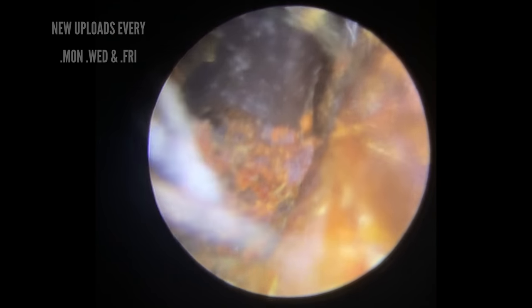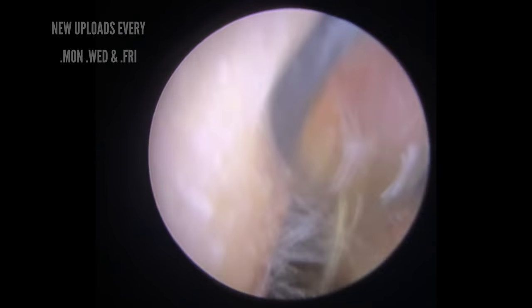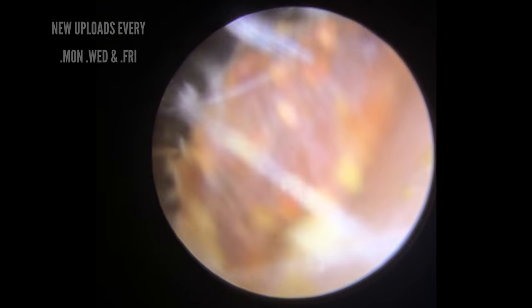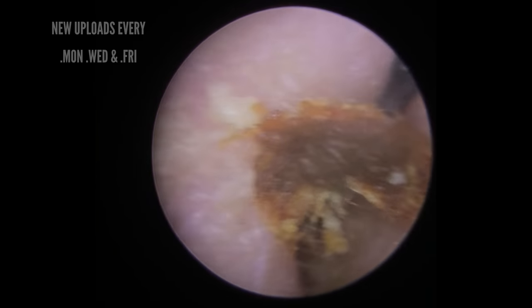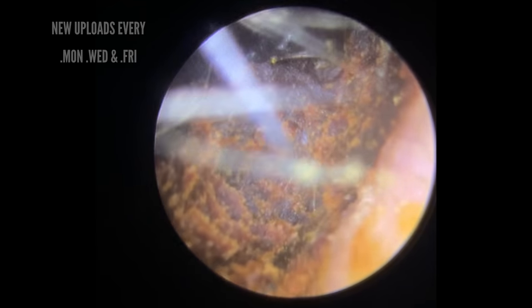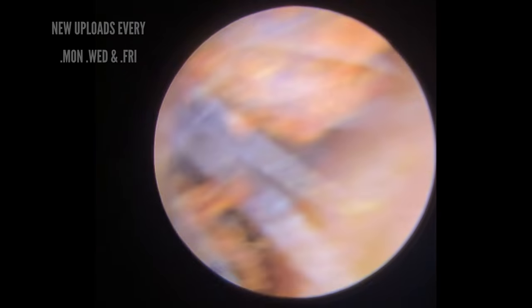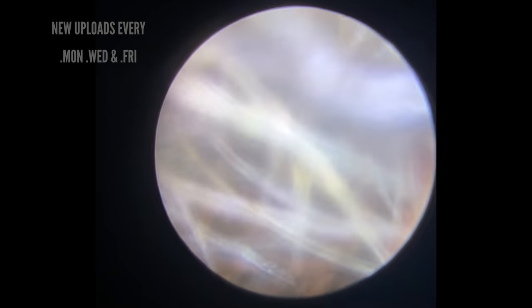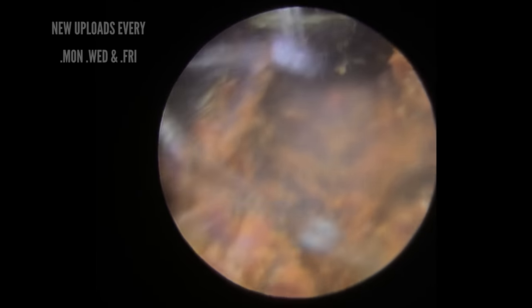Now, one thing about the Jobson horn — this is the most circular type. What you've seen me use a lot in the past is the more oval type, which does help to get into thicker wax, but when you take a scoop you only take a very thin scoop away. I've opted for the more rounded Jobson horn, which has the benefit of scooping more away when you do get purchase — but the downside is that with this consistency of wax, the more rounded end doesn't push in quite as far as the slightly more pointed oval end.